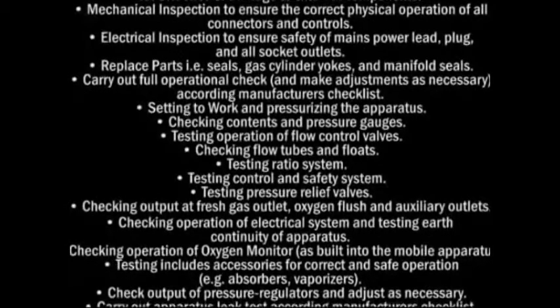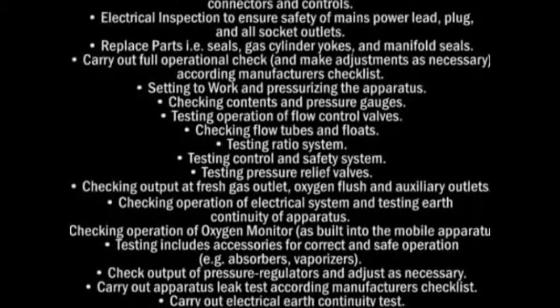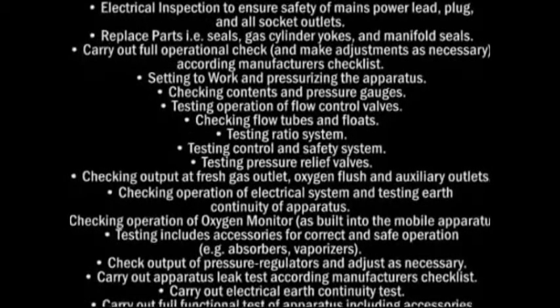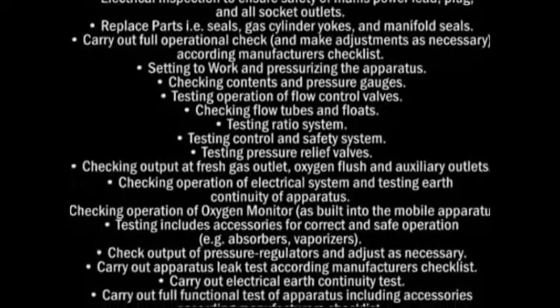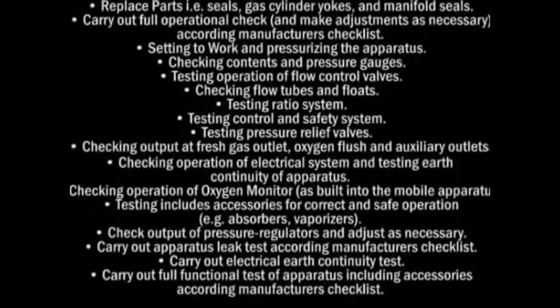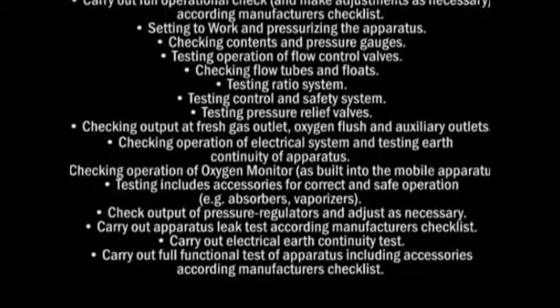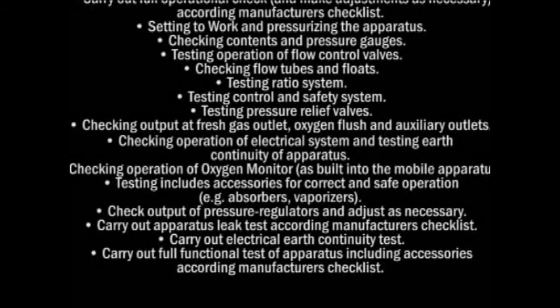Testing includes accessories for correct and safe operation, for example, absorbers, vaporizers. Check output of pressure regulators and adjust as necessary. Carry out apparatus leak test according to the manufacturer's checklist. Carry out electrical earth continuity test. Carry out full functional test of apparatus including accessories according to the manufacturer's checklist.